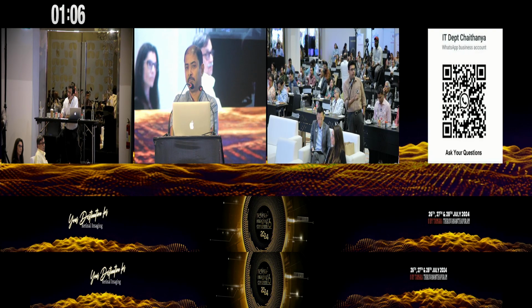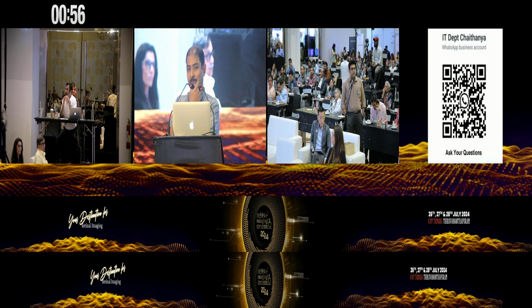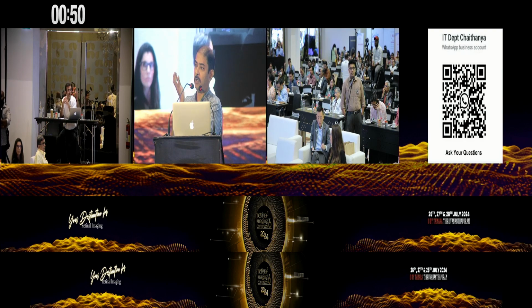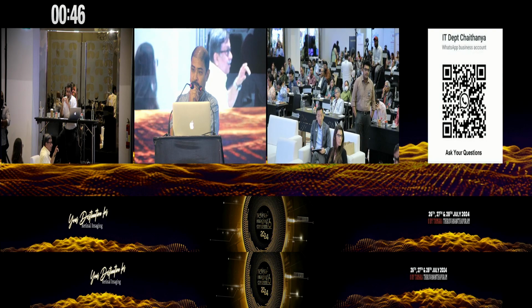At that stage, we will have to differentiate from the pseudocyst as well as understand whether there is an RPE breach, or a case which Pradeep showed where there was a restart or a starting of a CNV. Or it could be ORTs. Or it could be an ORT. That is a little too presumptuous. I think everyone would be able to differentiate an ORT from an intraretinal cyst, so I won't go to that extent.